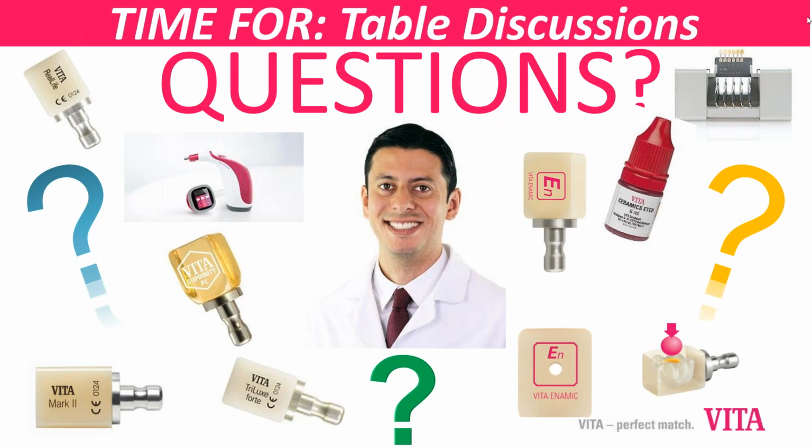I think that it's very important, if you're doing night guards from an intraoral scan, to pay close attention to the proximal surfaces of that scan, the embrasures, because that's exactly where the night guard gets the retention. I don't really change any of the parameters when I'm designing the night guard, but I make sure that I scan the embrasures and the proximal surfaces very well, so the night guard has a nice intimate contact in those areas, and then it has nice retention without creating too much stress on the teeth.